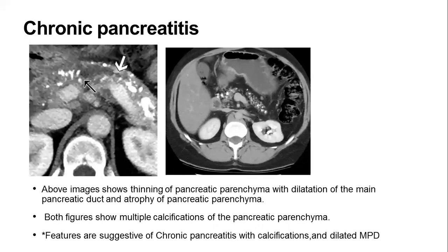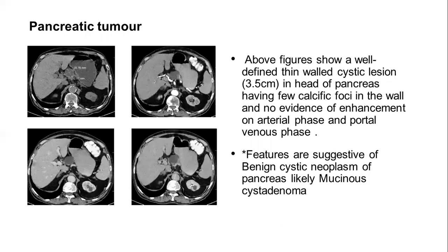This is a case of chronic pancreatitis. There is thinning of the pancreatic parenchyma with dilation of the main pancreatic duct and atrophy of parenchyma. This is a case of a pancreatic tumor. There is a well-defined thin-walled cystic lesion in the head of the pancreas with a few calcific foci in the wall, features suggestive of a benign cystic neoplasm of the pancreas.